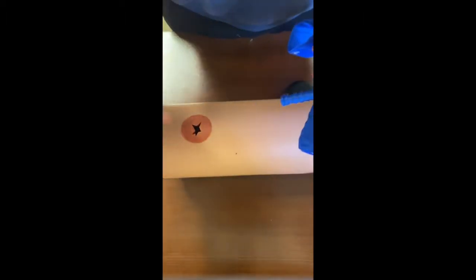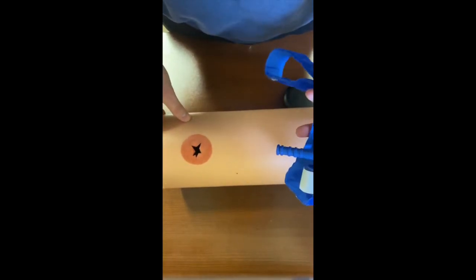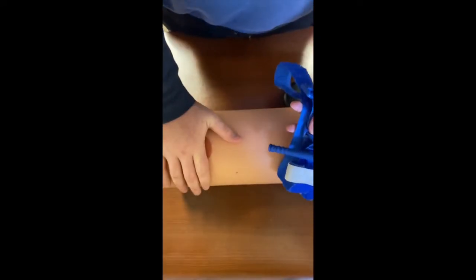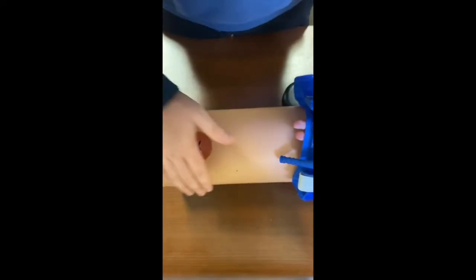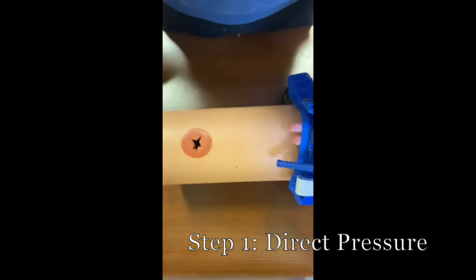So right here we've got our injury simulator, just to know where we are. The patient's foot is down there. So we have an injury right here. The first thing we want to do is apply direct pressure, step one. Step two, if that's not working, we're going to move to tourniquet application.